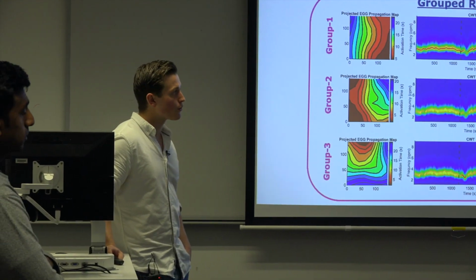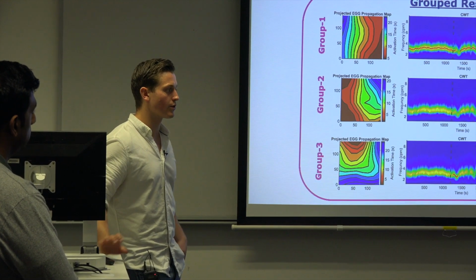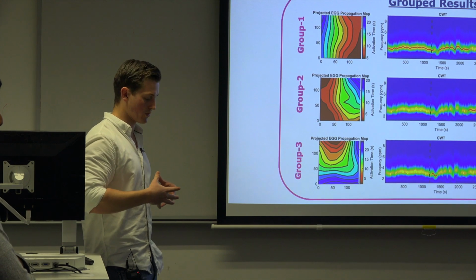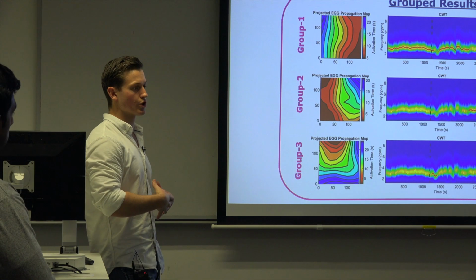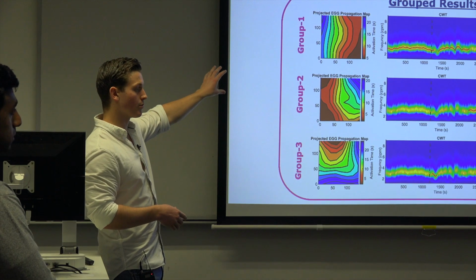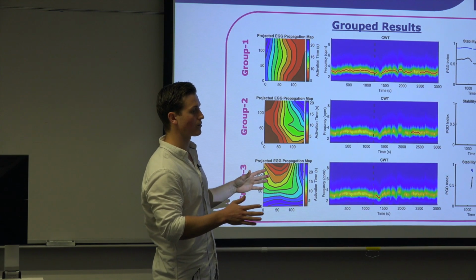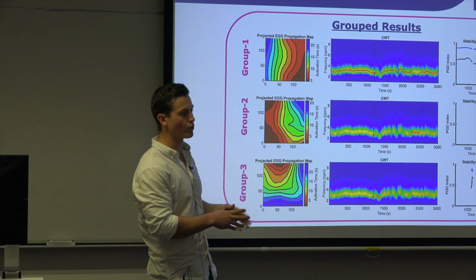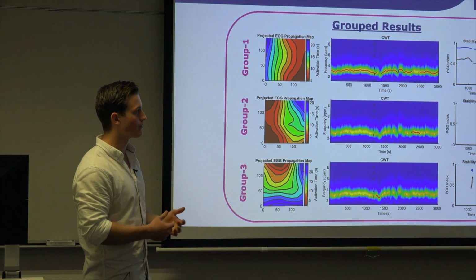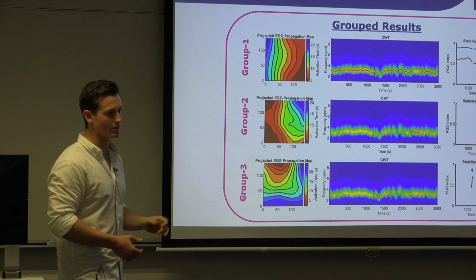I don't think velocity will be a good metric for diagnosis in theory, because depending on the orientation of the stomach, that velocity is going to change. Also, if I misplace the array, the velocity will change as well. But the actual propagation map, the directionality, should be consistent across all patients, regardless of how the array is placed, regardless of your body structure. So you're right, the velocity is probably not a good metric, but the projected propagation map is.